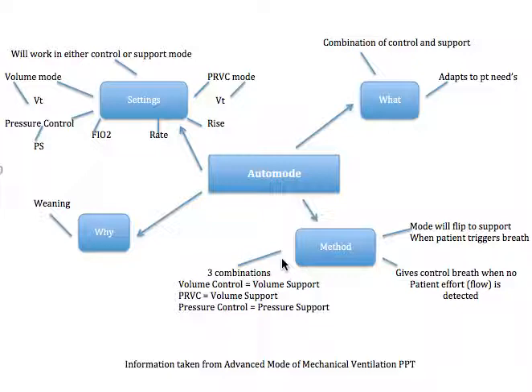So there's three combinations that can go with this. There's volume control or volume support, PRVC, volume support, and there's pressure control and pressure support.